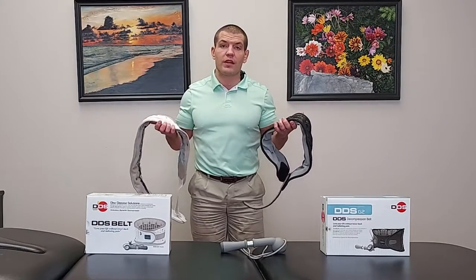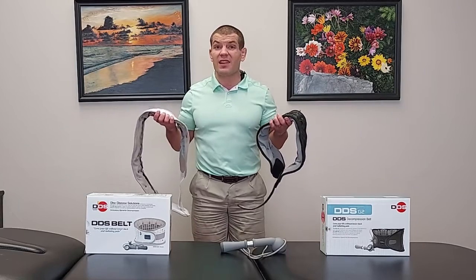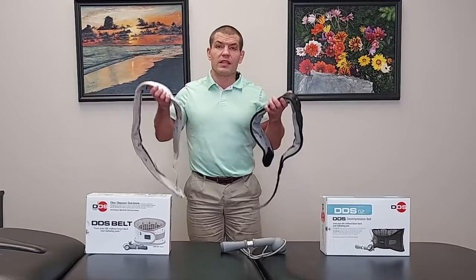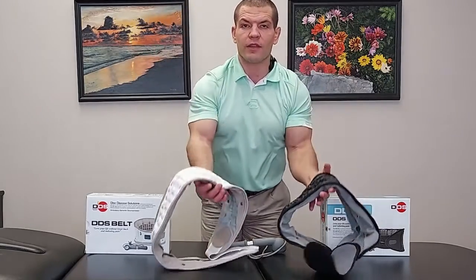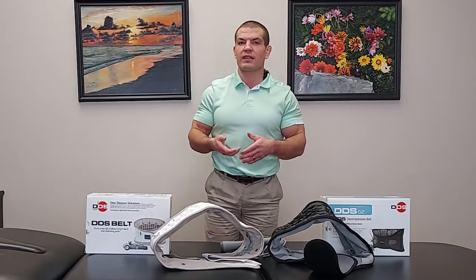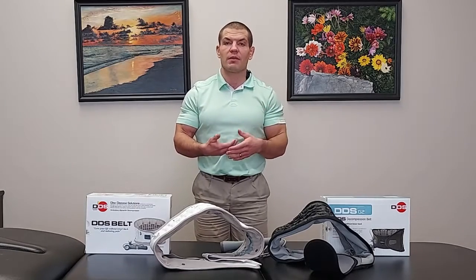I've done individual review videos on each of these that you can check out separately, but you'll notice that a lot of the features in the two videos are pretty much the same. Both of these braces are different from regular back braces in that they don't just compress around you — they help unload the effect of gravity, expanding vertically to relieve compression.